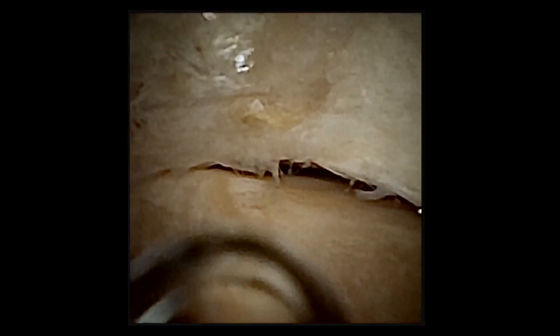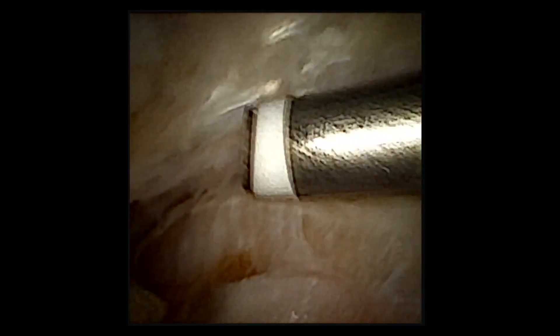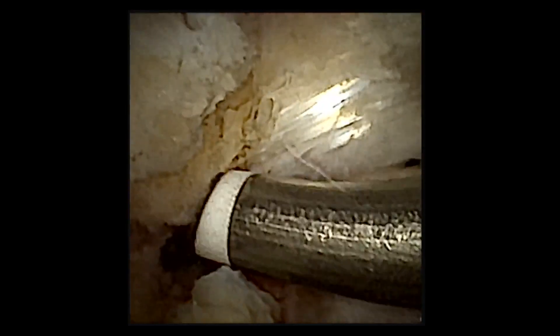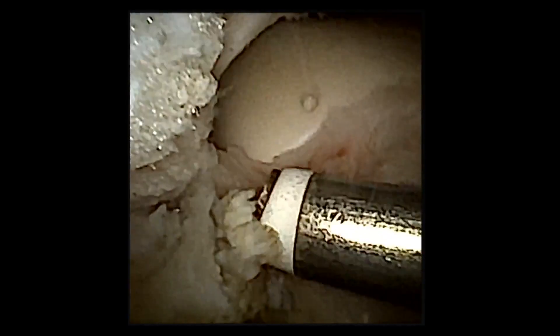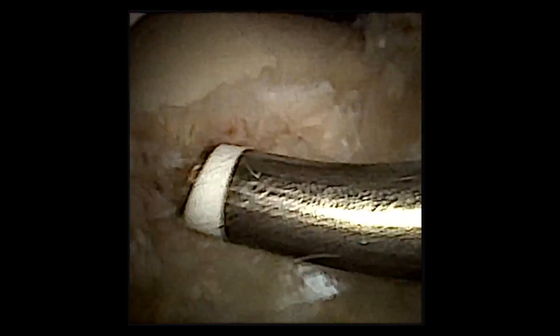We've already established visualization — we've been in with the shaver and the SJ50. With the SJ50, you can get the edge and it continues to suck and ablate. As you know, if you've done posterior ankle arthroscopy, going after this tissue and developing the plane, you really have to take down that posterior capsule and some of the inferior branch of the PITFL.